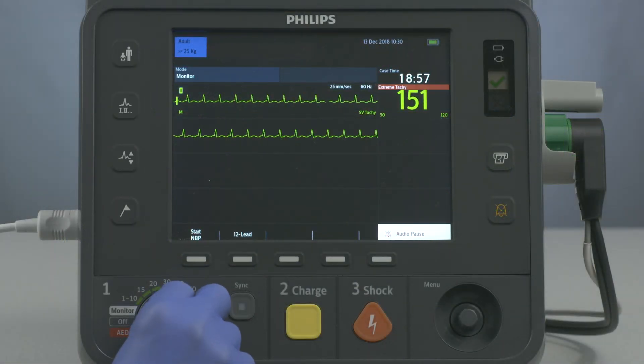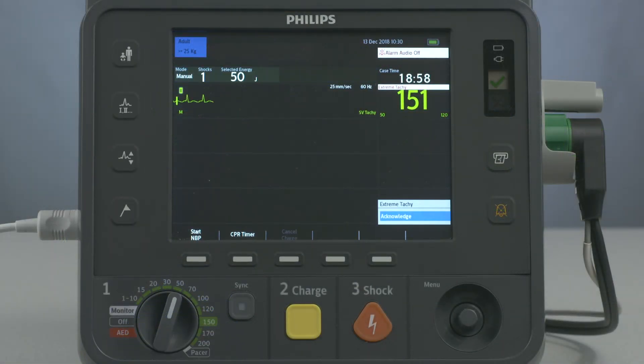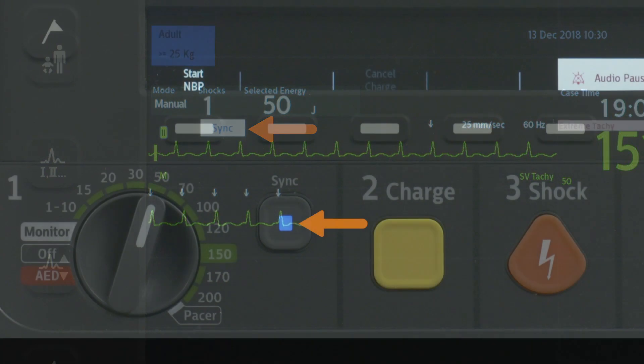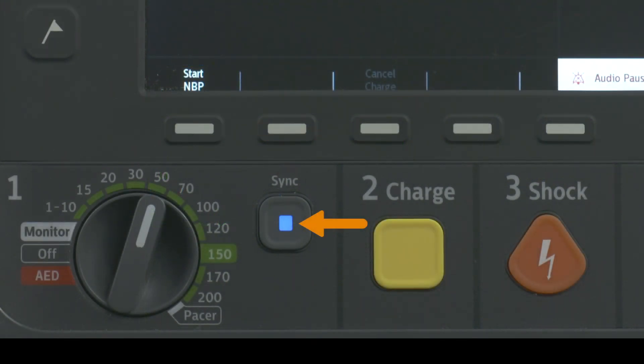Turn the therapy knob to the desired energy level setting and press the Sync button. This message appears, and the backlit Sync button illuminates, indicating that Sync mode is active.